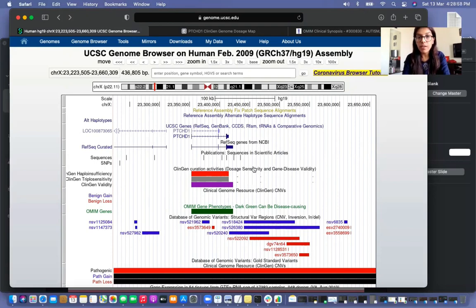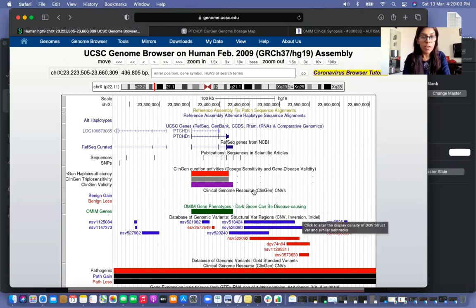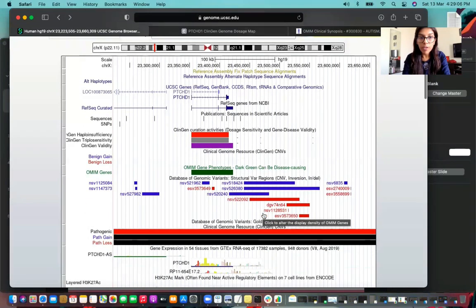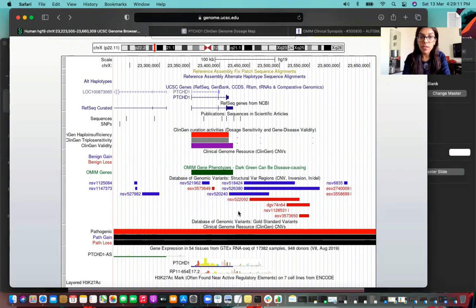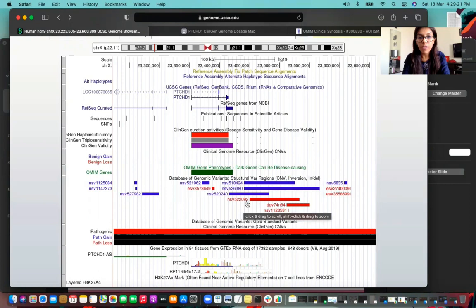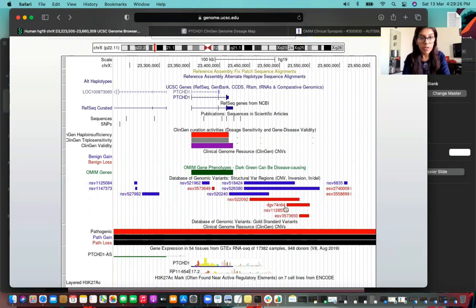We also see that the CNV overlaps with the ClinGen dosage sensitivity map. Looking at the DGV data, our CNV does not represent common variation. While there are a few variations present in the region, they do not intersect with the coding material, confirming this is not a common variation according to the population-scale database of DGV.